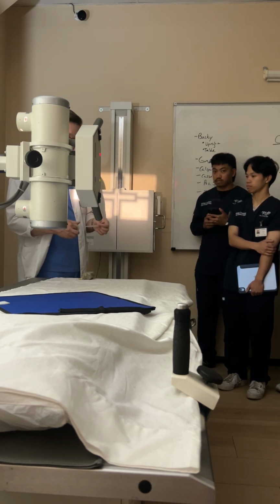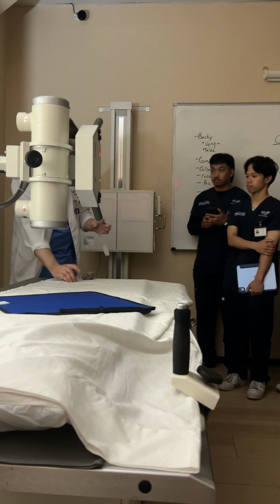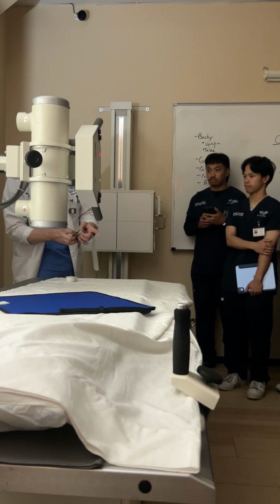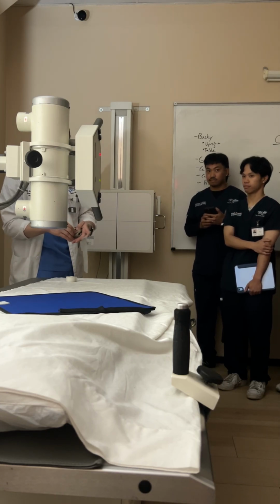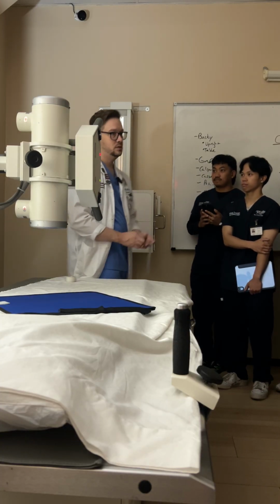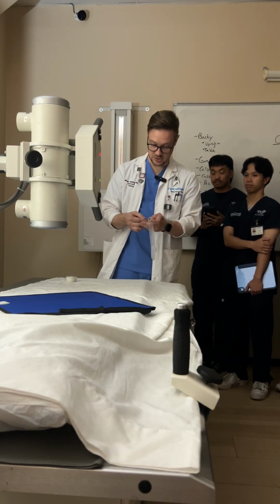What else did I want to say? What is your breathing instructions for a PA chest? Yes. So, how does that sound? How's that going to sound when you're giving your instructions to your patient?